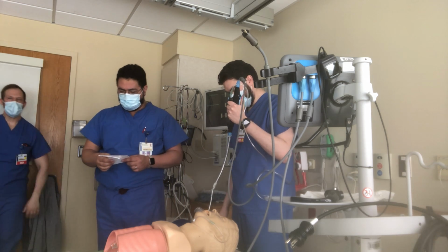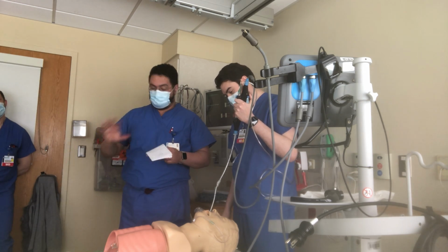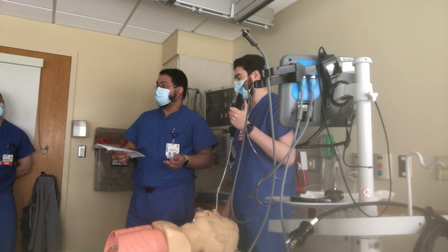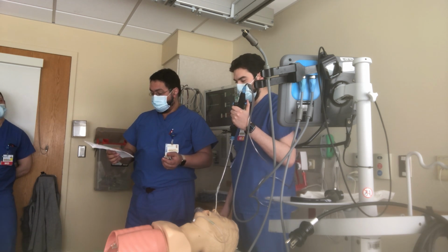So anyway, preparing for the fiber optic scope. As you're preparing, the patient vomited now. He has a small bowel obstruction, right? And his saturation is 90%. And so what are you gonna do?